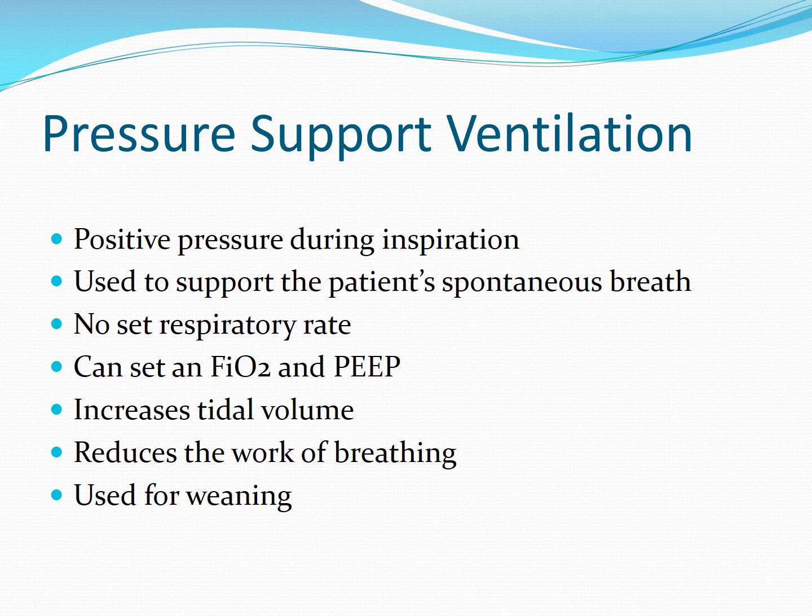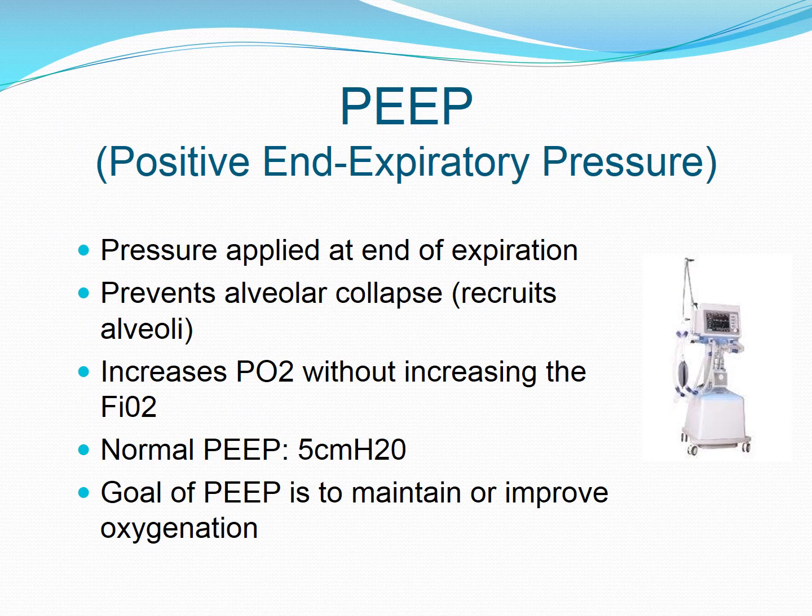So what it's trying to do is help this patient get a higher tidal volume. You can also, on pressure support ventilation, set an FiO2, and you can also set a PEEP on this patient, but it does help to reduce the work of breathing, and this is also used in the weaning mode.